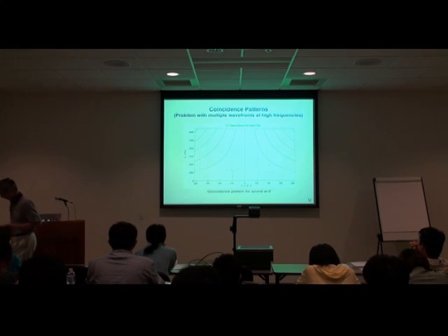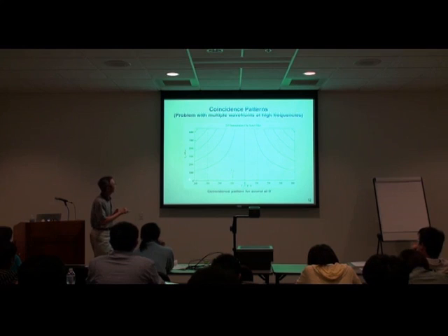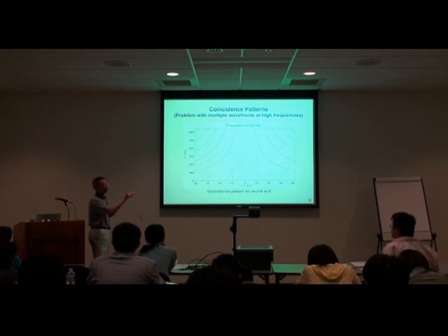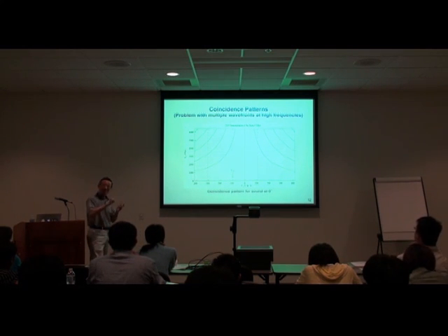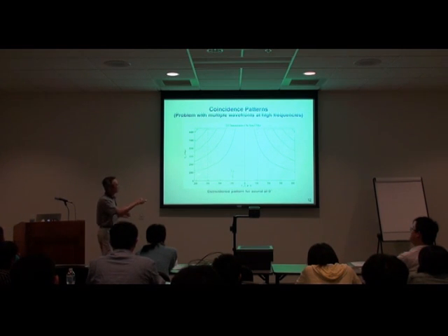But there's a problem with this scheme. You divide the sound into the various spectrum, low frequency all the way, let's say, to 6 kilohertz. But with increasing frequency of the sound, the waveform period gets shorter and shorter, right? At low frequency, there is no ambiguity in the coincidence detection.